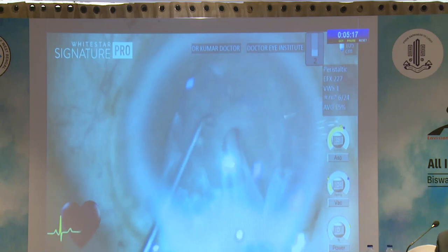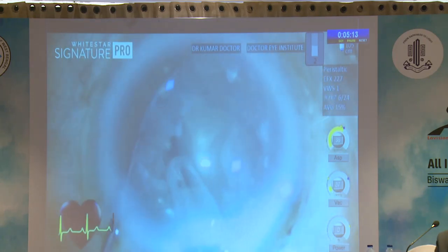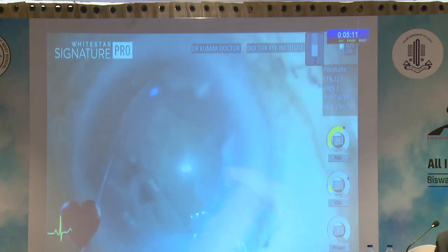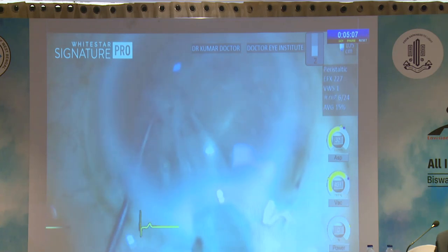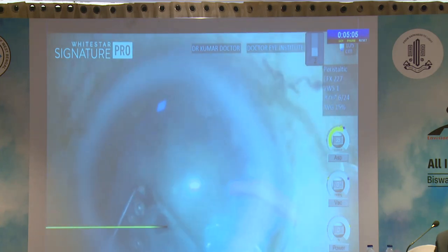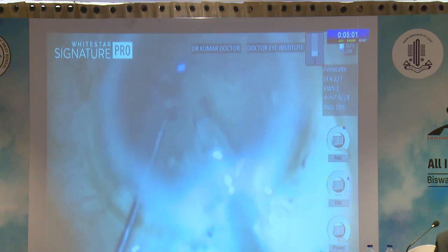Trying to get the nucleus piece by piece, but the only thing that it is doing is rotating, and a small piece of the nucleus is coming up every now and then. We go ahead and try to catch the dense part of the nucleus, and yes, we have a PC rent. There's a pupillary snap noticed. The PC is now breached.